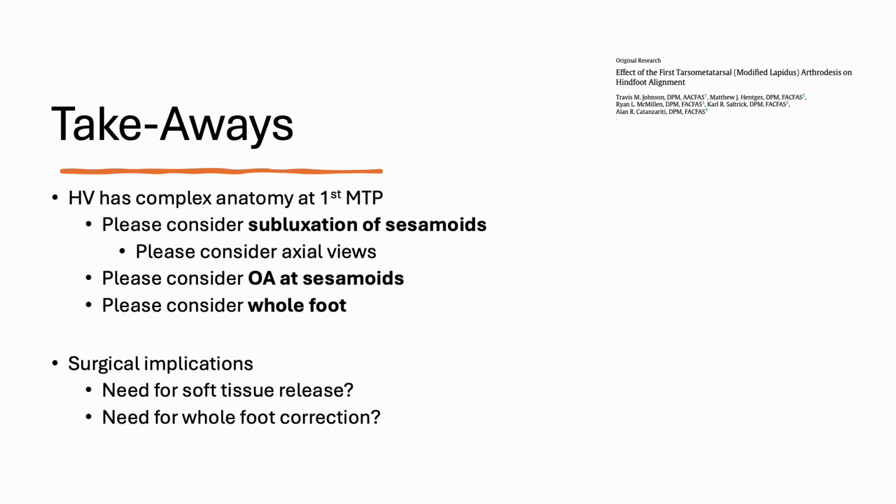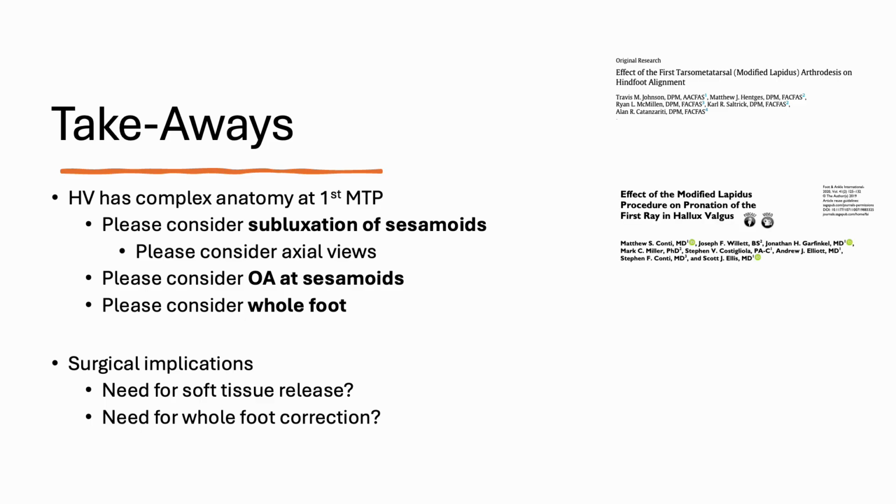There are some good studies on the Lapidus procedure. There are some good studies on pronation of the first ray, and there's a good study on elevatus with hallux valgus and flexible flatfoot. So there are studies out there that prove why I like getting a weight-bearing CT scan on bunions and evaluations of them.